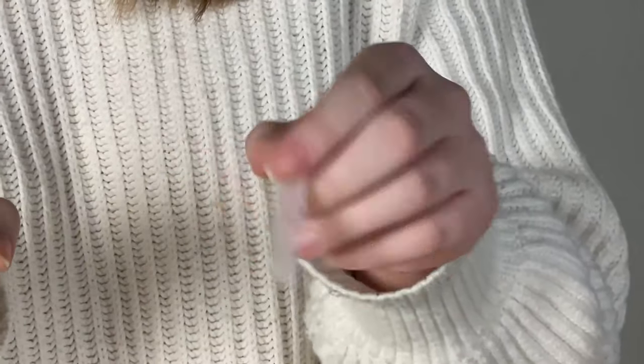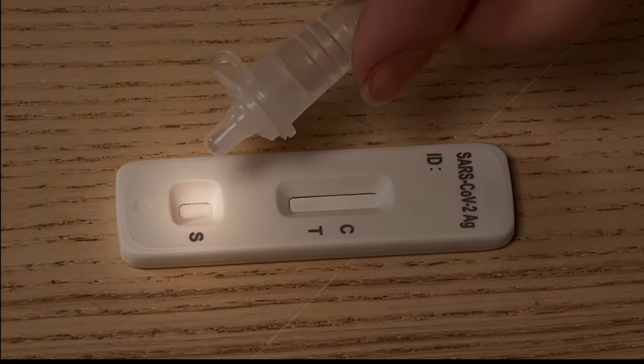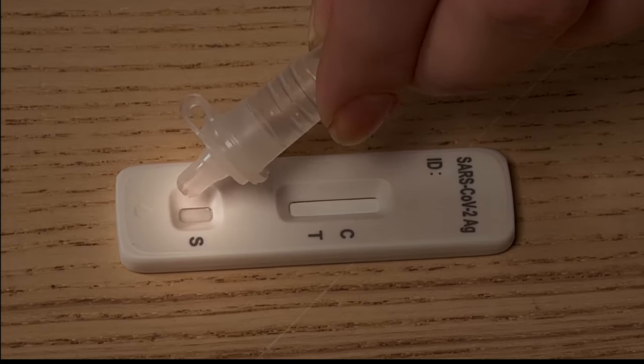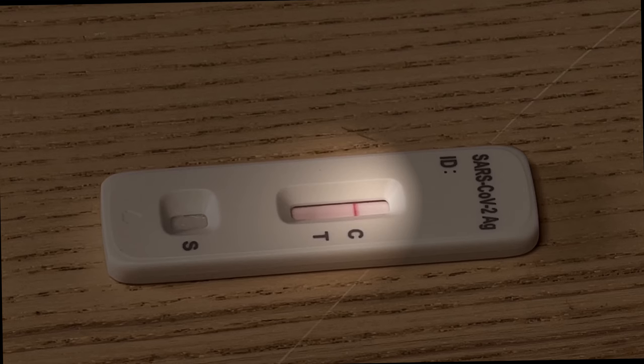Mix thoroughly by swirling or flicking the bottom of the tube. Gently squeeze four drops into the sample well of the cassette. After 15 minutes, check the result window of the cassette.